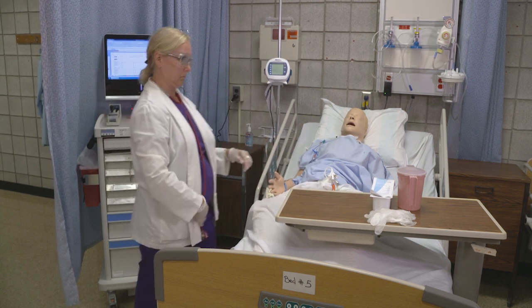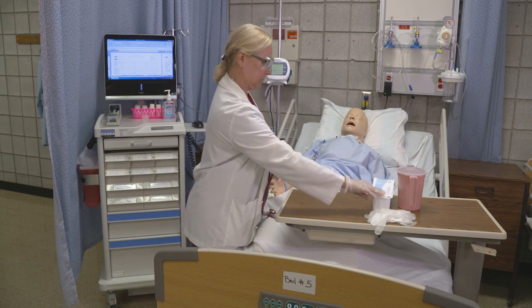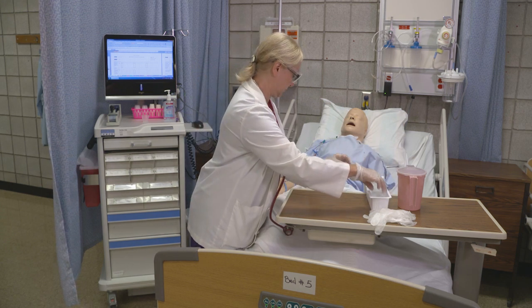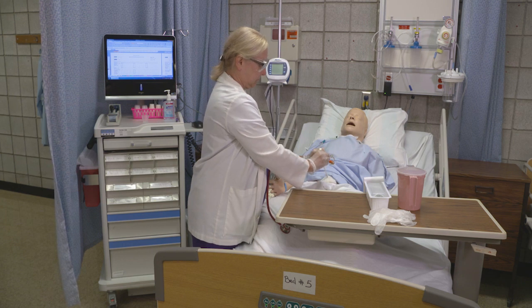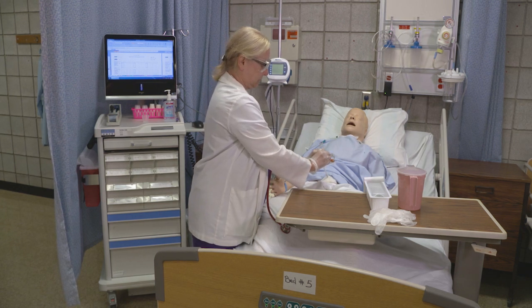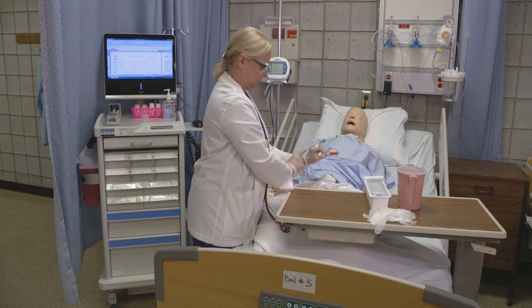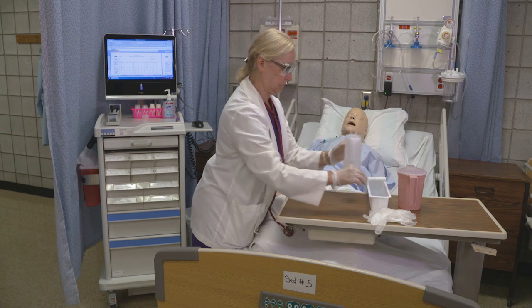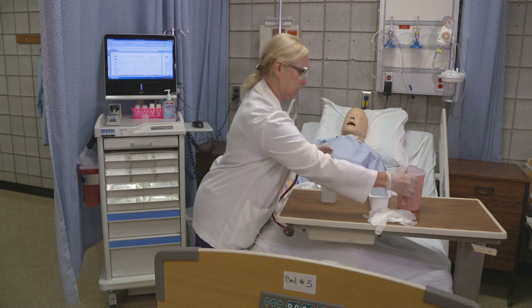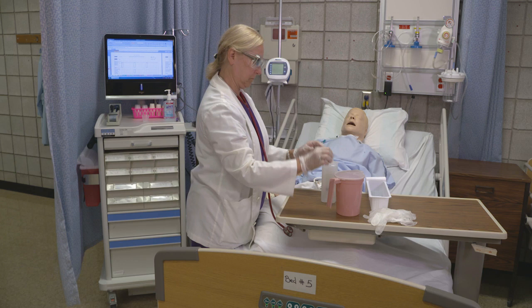The stopcock must be in closed or off position when not in use. The stopcock must be in open position when checking for placement, administering medication, and flushing with water. The next step is to assess for tube placement in the stomach cavity prior to administering meds and/or feeds.